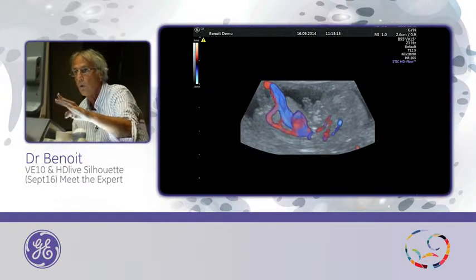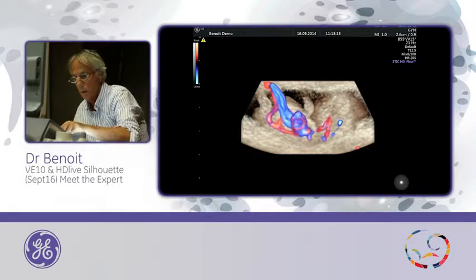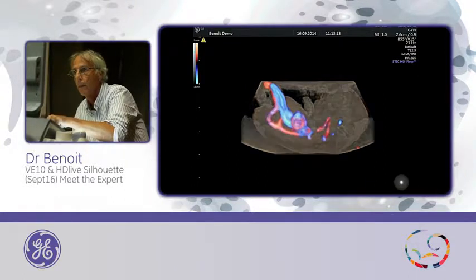Now I will choose main render and I will choose HD Live. And with silhouette, I will do it.